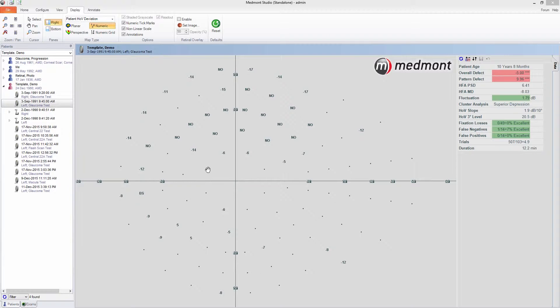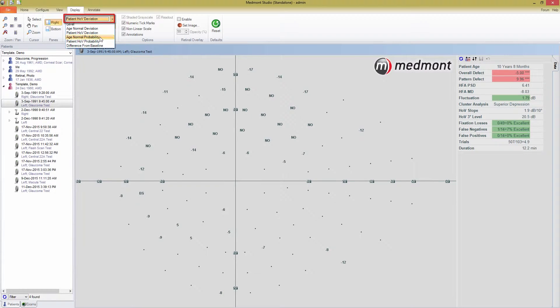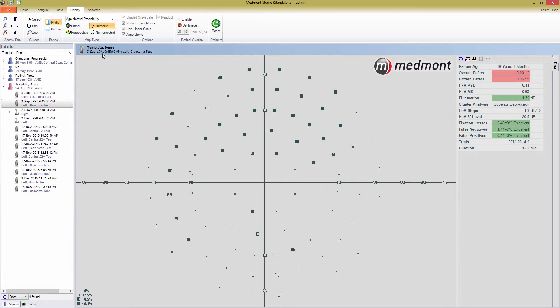We now move into the probability maps. The next map view available is the age normal probability. This map is similar to the age normal deviation, but rather than give the raw difference in thresholds between the patient and the age normal, it rates their statistical significance.